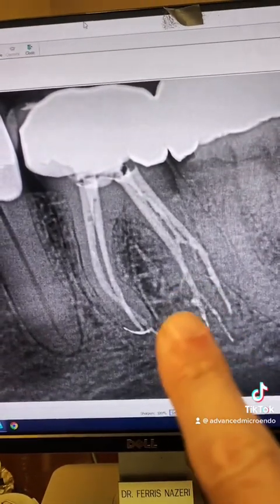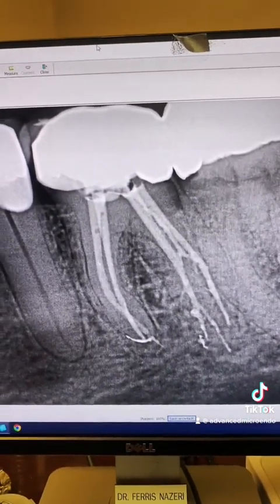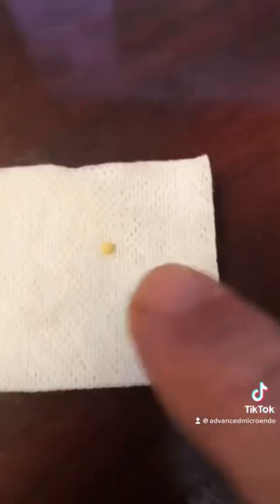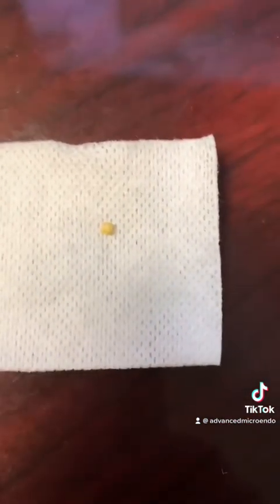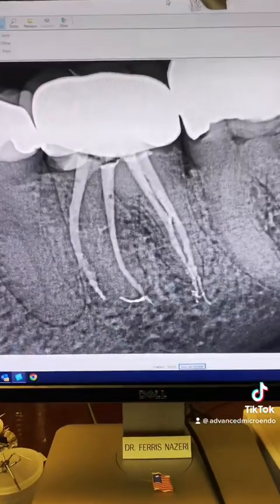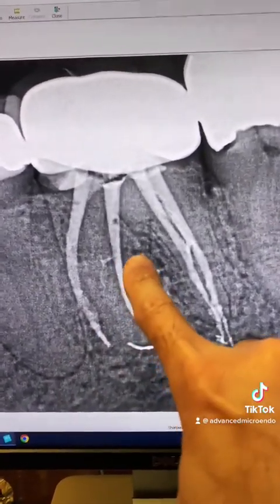Look at all of this anatomy here. Look at all these laterals here. All right, let me show you a different angulation so you can appreciate it even more. This is a pulp stone that I removed from the pulp chamber. Look at how big that pulp stone is. Look at this angulation. We opened up the mesial roots and take a look here.